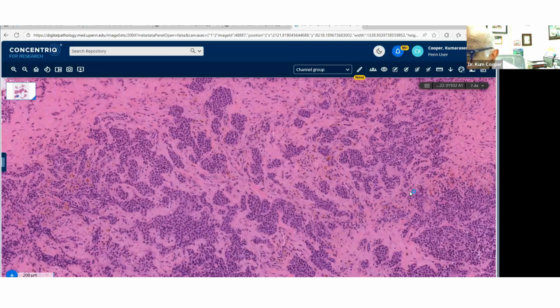Melanoma. Okay, we have another melanoma here. We have PEComa. We have Ewing as well. And we have got melanoma markers still cooking. Okay, I promised you HMB45, Melan-A. That's going to be coming. Looks too epithelioid. Cytokeratin negative. Yes, Maria, it's negative. It does look epithelioid. And this can be soft tissue ependymoma. Yeah, that's a question, Michael. That is a question. That's what we have to deal with.